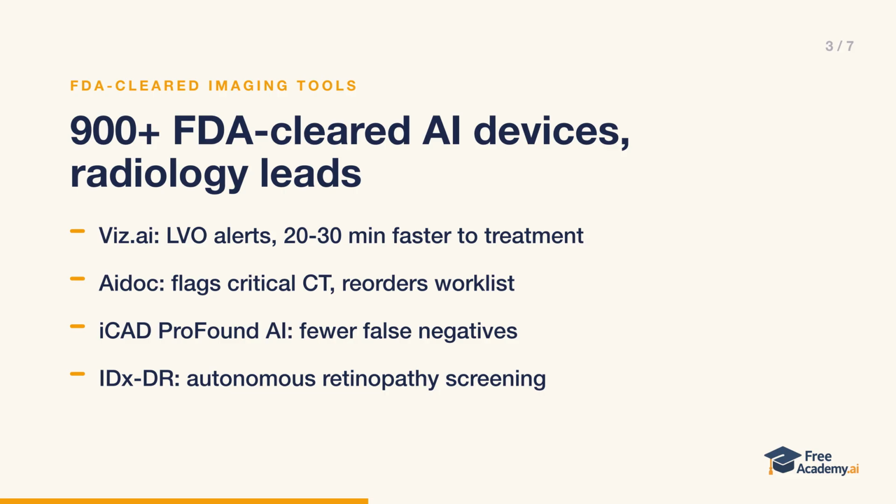iCAD ProFound AI assists breast cancer detection in mammography and tomosynthesis, reducing false negatives while maintaining specificity. IDx-DR detects diabetic retinopathy from retinal images and is one of the few systems authorized to make a screening decision without specialist review, built for primary care. AI is advancing in pathology and dermatology too, but those tools are less mature, so apply more caution.